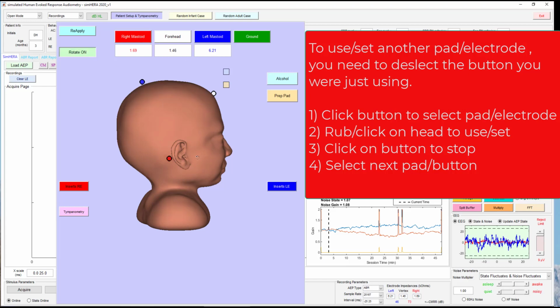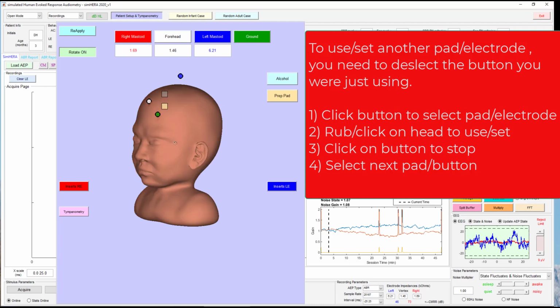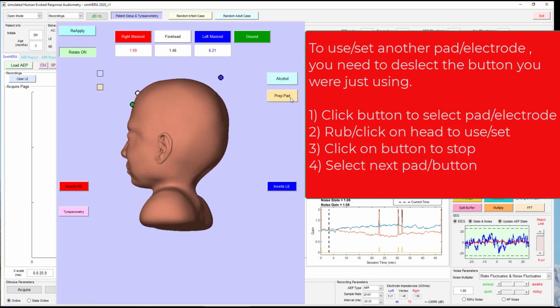And if you note down in the right in the EEG, you can actually see that the red EEG line is a lot quieter than the blue, and that's because the impedance of the left mastoid is still quite high here, whereas the impedance of the right mastoid is 1.69.